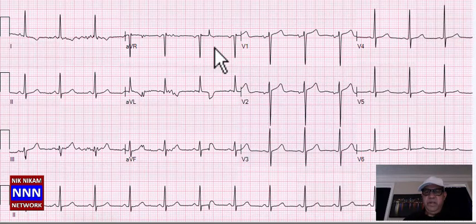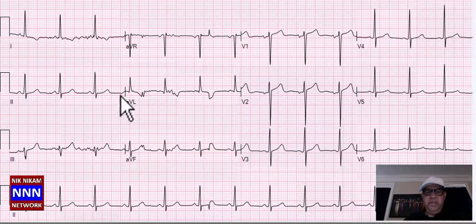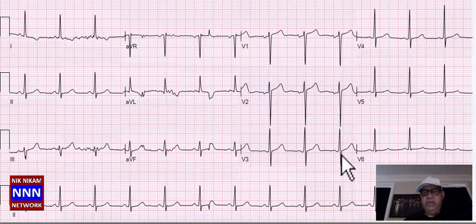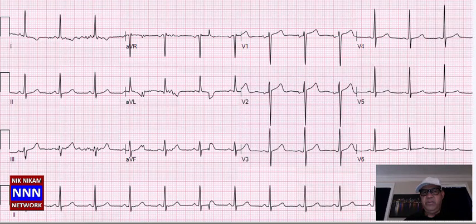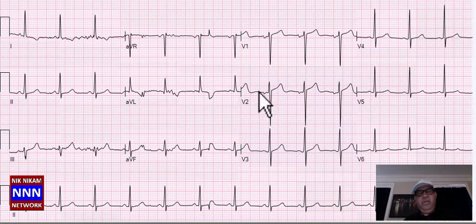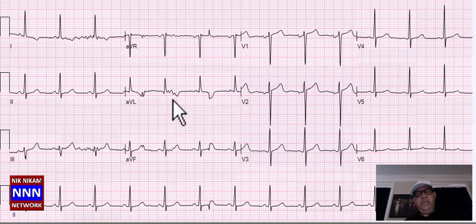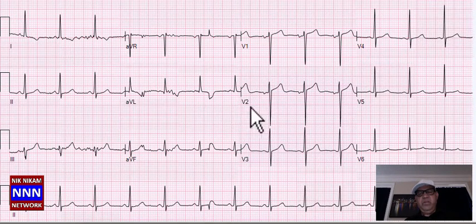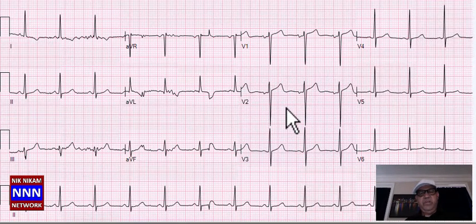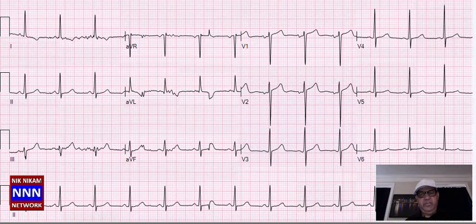Here we have another sinus rhythm. Inferior leads look all right, anterior leads look okay. Laterally there are some non-specific T-wave changes, and in the high anterior leads we also have some T-wave inversion. Sinus rhythm with non-specific T-wave changes.